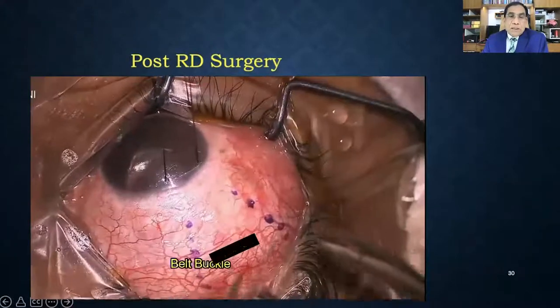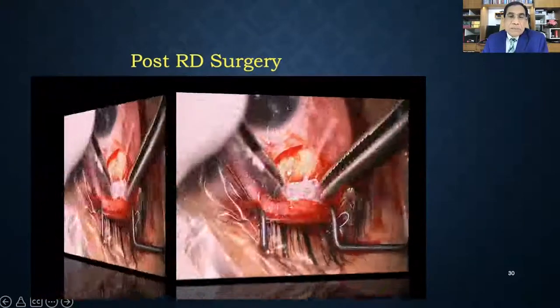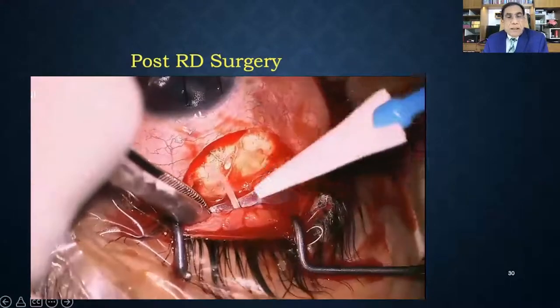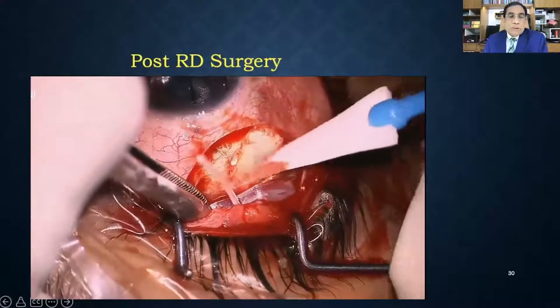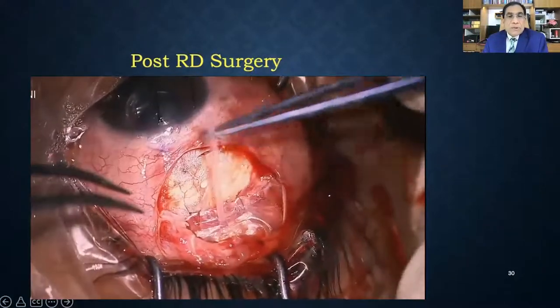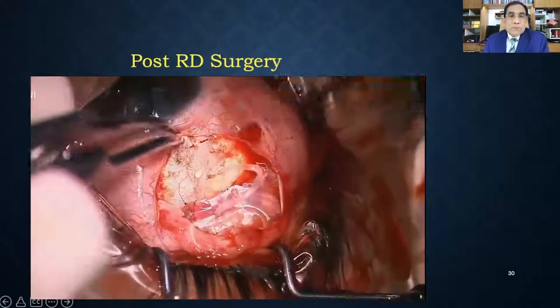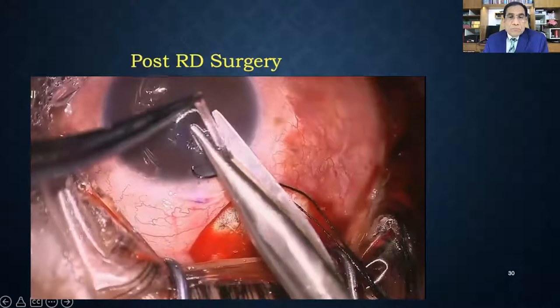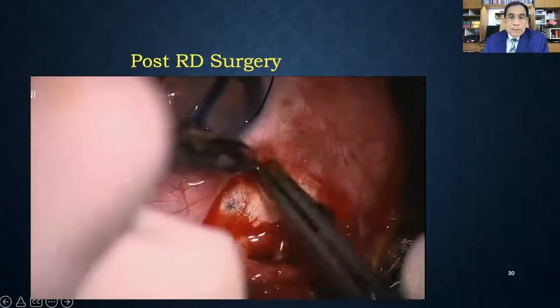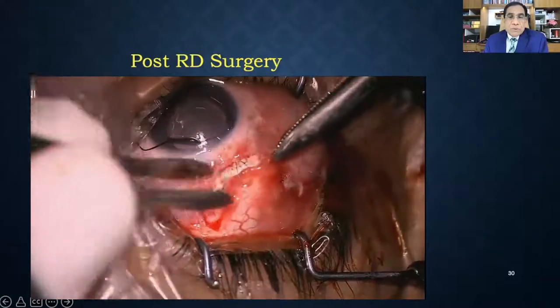Another challenging case is post-vitreoretinal surgery with very high IOP. Retinal colleagues often refer patients where trabeculectomy does not help. In these cases, valve surgery with the STSF technique is performed, essentially the same way as shown in the standard AGV video.